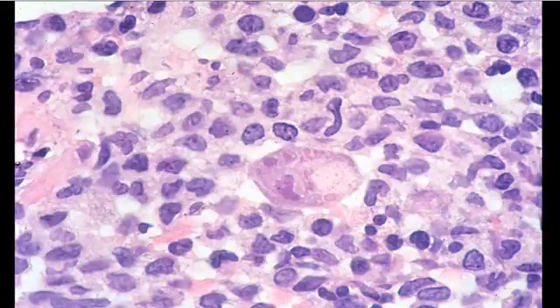And when someone's on antiviral therapy, the inclusions often look more like this, where you just get these weird granular inclusions in the cytoplasm, and the nucleus doesn't look as good. And sometimes you're not sure. It's easy enough to throw a CMV stain on this. But I'll always hold out to make sure what you're looking at is really a CMV inclusion, because CMV stains typically will cross-react with some of the plasma cells in the lamina propria of an ulcer, and I typically will ignore that.